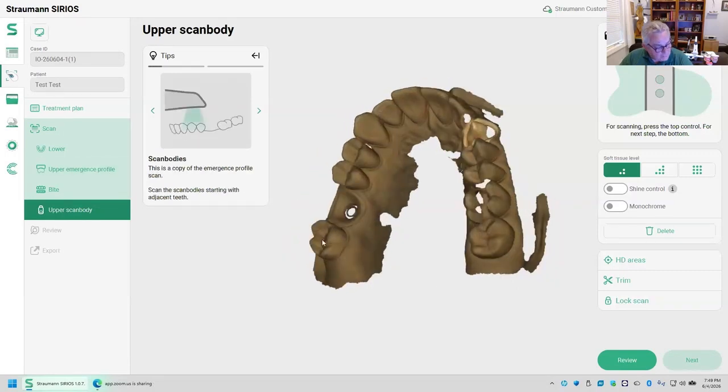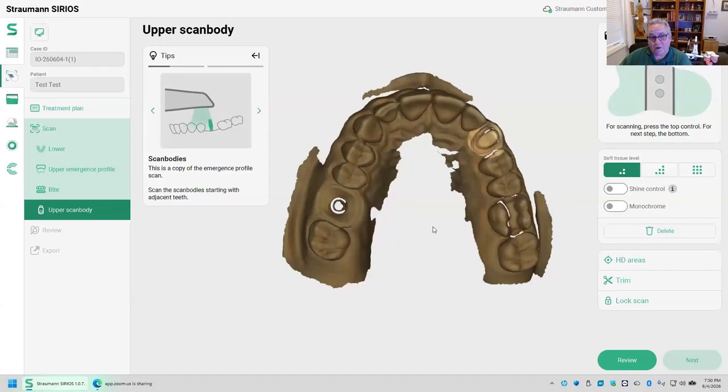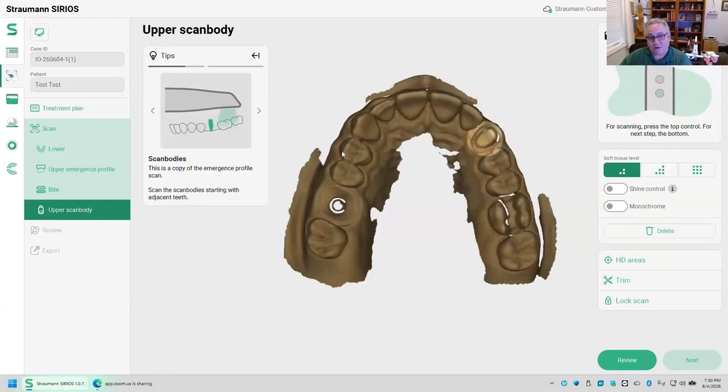Now, all I have to do is scan. Do I still have it in there? Yeah, I do. Okay, my scan body is still in the model. So all I have to do is get my scanner reattached to the arch. And for those of you that have used almost any scan body, you know that means just hover over somewhere you've been before. So I've been all over this arch before. So for the sake of ease, I'm just going to come in and pause over my bicuspids.